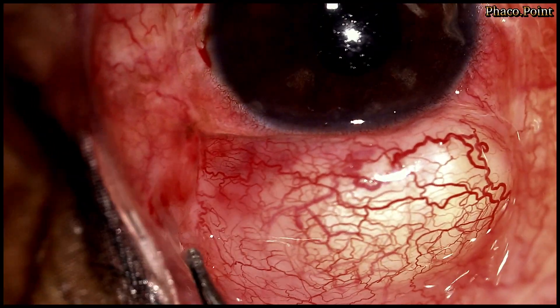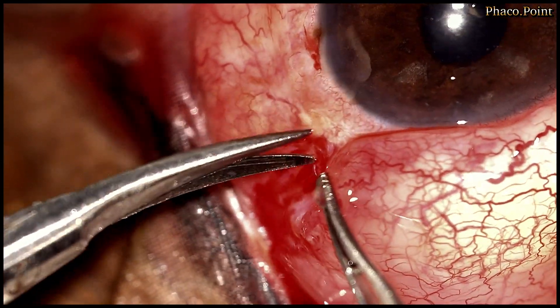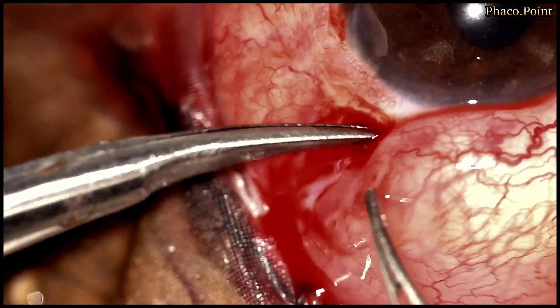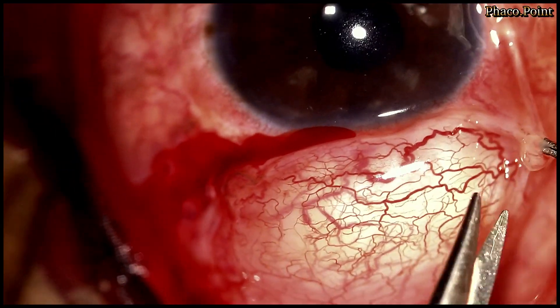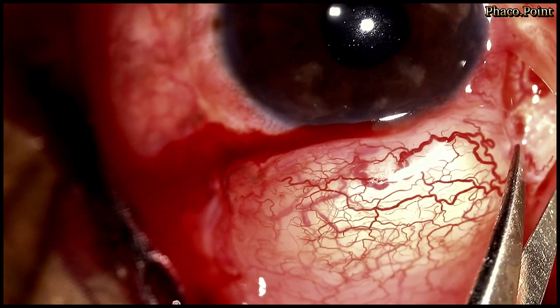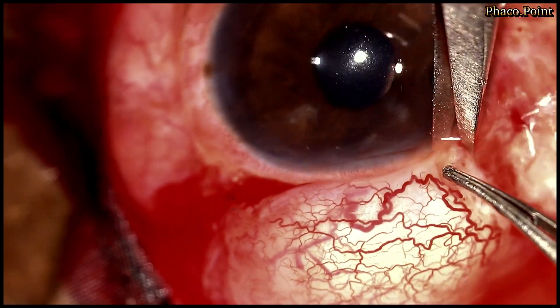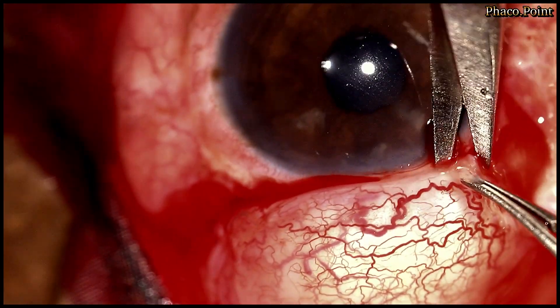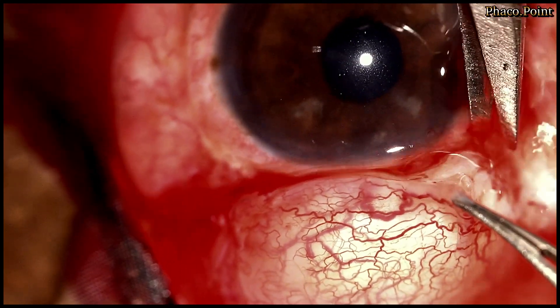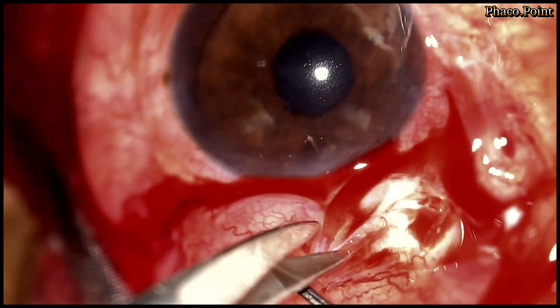Having done that, the next step is exposing the cyst. A subconjunctival dissection is performed to expose the cyst — this is what you will see in this part of the video. With care and caution, making sure that we do not accidentally rupture the cyst, the subconjunctival dissection is performed.